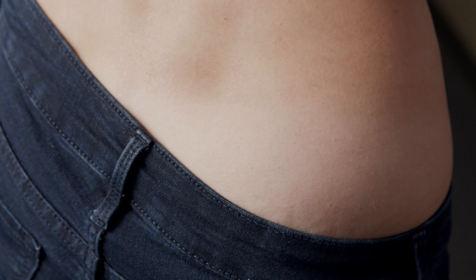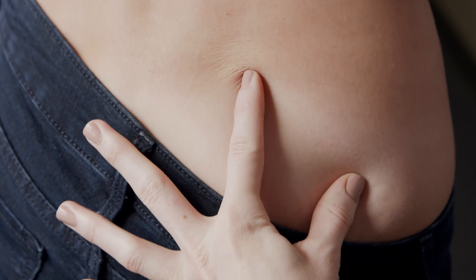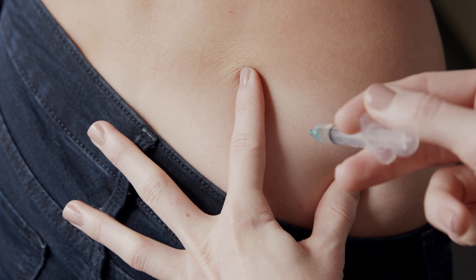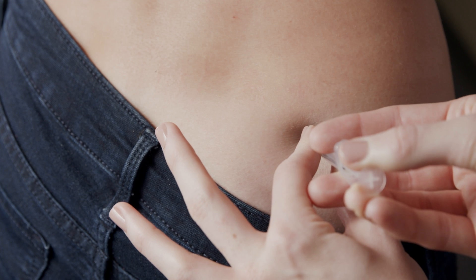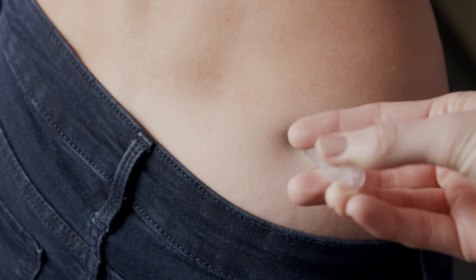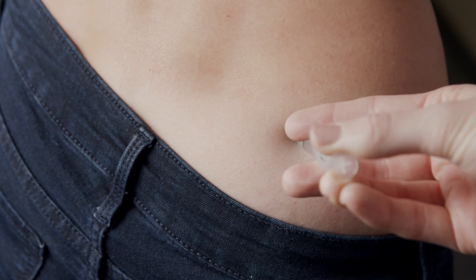Take the syringe in your preferred hand. Stretch the skin between your fingers at the injection site and insert the injection straight into the skin. Pull back slightly on the plunger. If no blood enters the syringe, proceed with the injection. If blood does enter the syringe, remove the needle and reinsert in a nearby clean injection site.